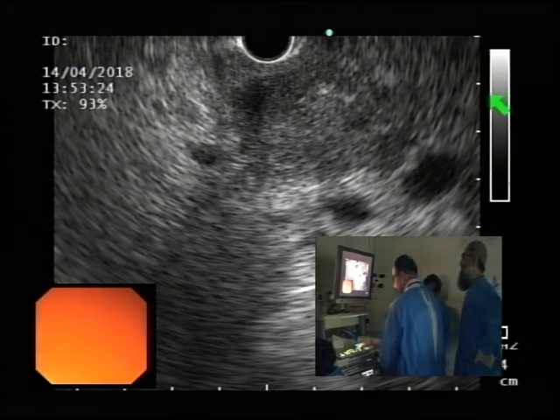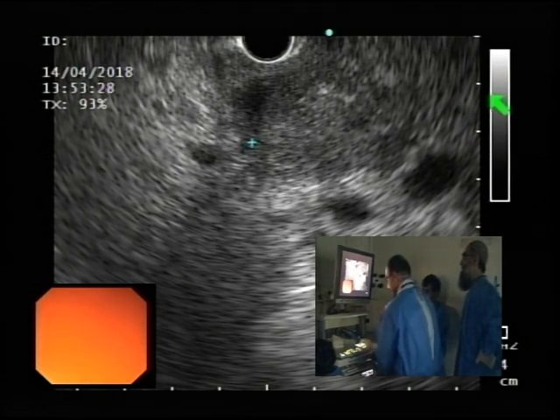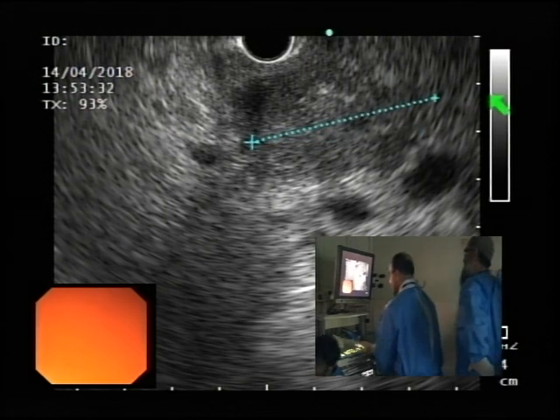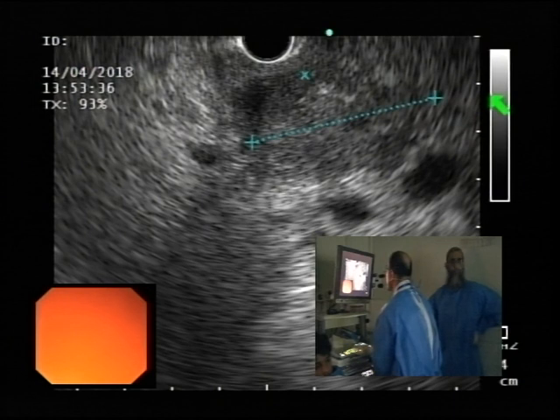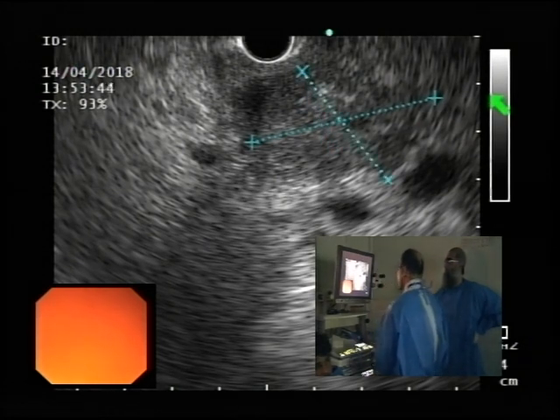I think we need to sample. It looks like a pancreatic mass which is involving the ampulla. Exactly. If they haven't sampled it, we should. Yes, I just need direction on what needs to be done. I think somebody should be there. We can ask them.